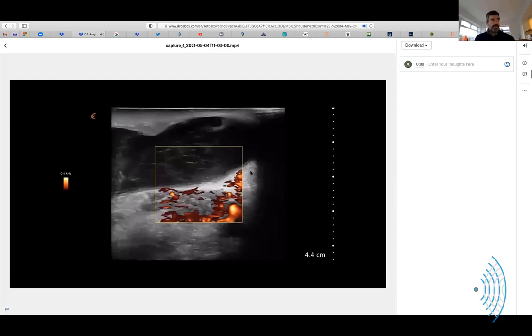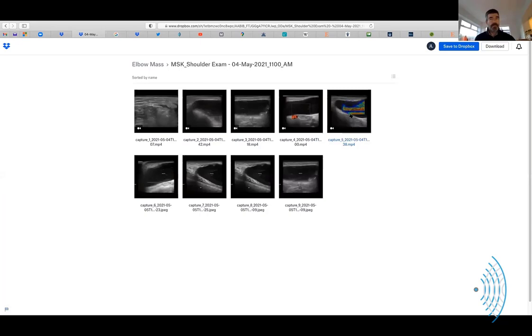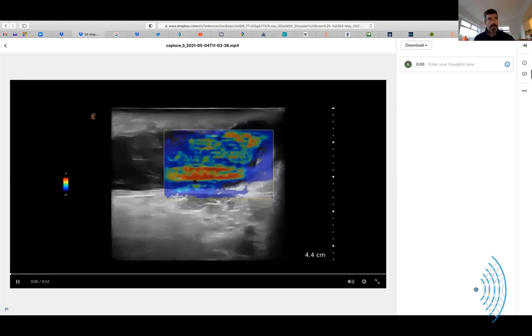Because it looks like there's some almost cellulitis type response in some of that hanging down fat that's around it. But you would expect that with one of these. You'd expect there to be minimal flow in one of those, maybe a vessel transecting it, but certainly no growth, no irregular flow. Would you pursue that zone that is actually a valve bringing fluid in?